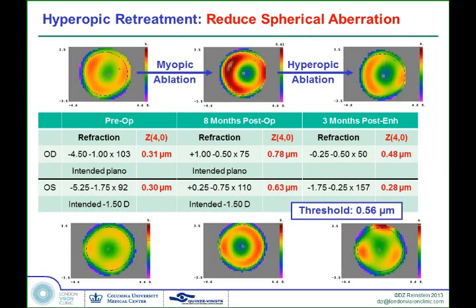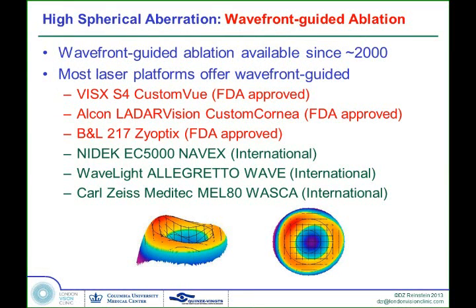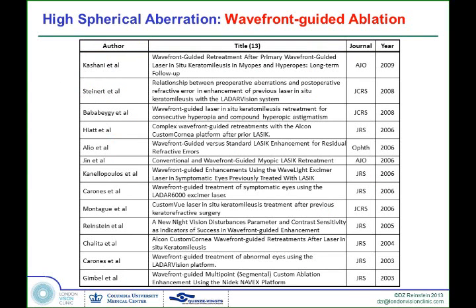Dan spoke a little bit now about wavefront-guided ablations. We know that these have been around since 2000. There are many laser platforms out there now. Most of them have a wavefront-guided option. And what we did is sample the literature, teasing out some of the big clinical studies relating to all these different types of lasers in very different centers.